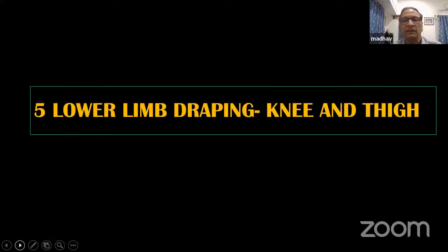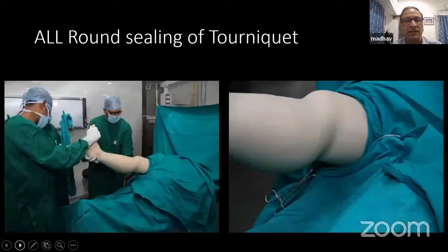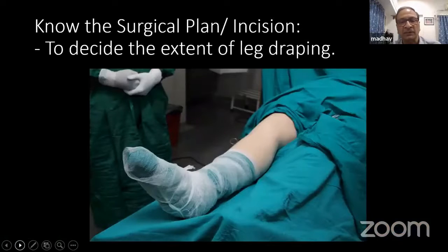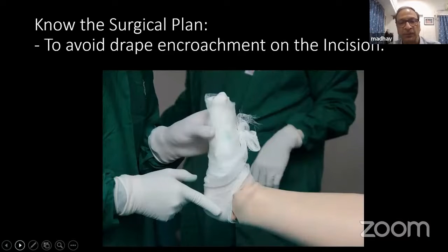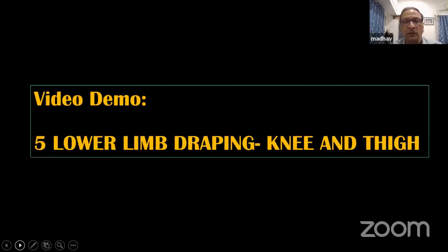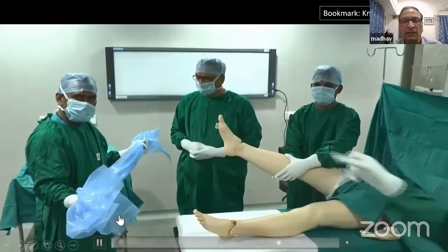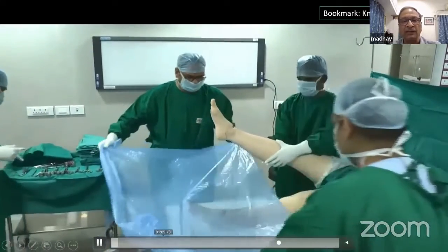Now, if you are operating on an area closer to the knee or the lower thigh, the technique basically remains the same. The only difference is that in the previous video, we isolated only the foot and ankle, but in this case — where your operating field is the knee or distal thigh — you don't want the rest of the leg left open, so you completely drape it inside and cover the leg, keeping only the operating field open.